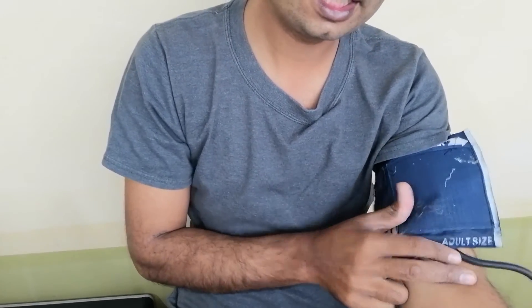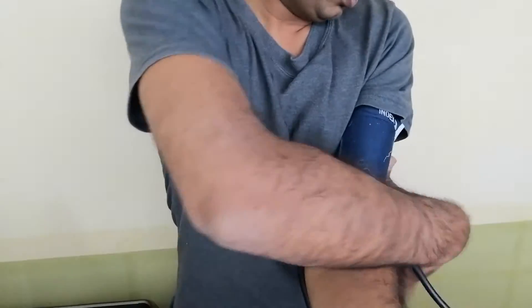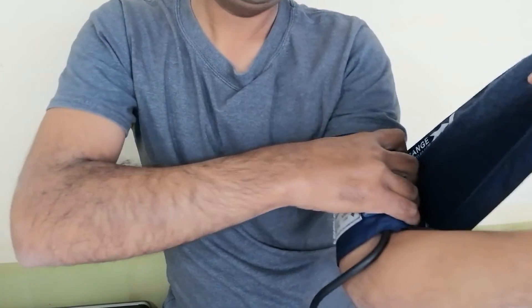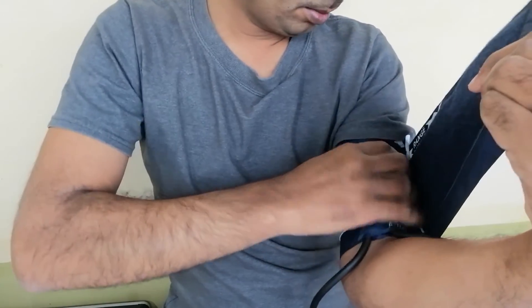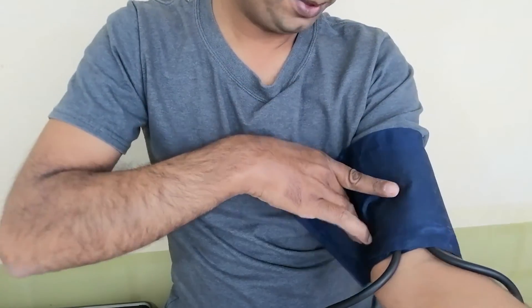I put it here. It should be an inch above our elbow. I press it with my hand and then hold it, and after pressing I tie it here. You don't have to tie it too loose, nor too tight.